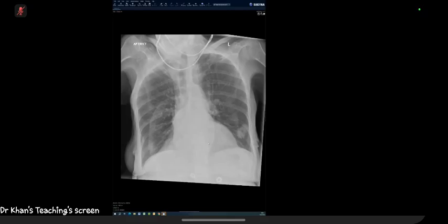So, for example, if it's in your reporting file, you pick it. If you miss it, it is an unacceptable miss. Yeah, even without the nodule in the left lower lobe, you have to pick that cancer. And unfortunately, the one cancer that we will all miss more than once in our reporting life is lung cancer, and it will be on a chest X-ray for exactly the same reason. Incidental lung cancers are picked up way more than cancers from two-week-wait pathways because of how much there is and how late they present.